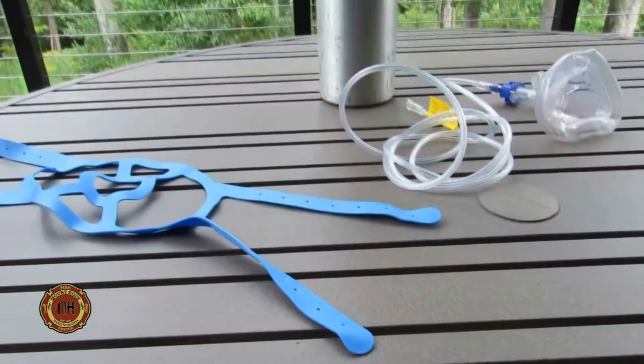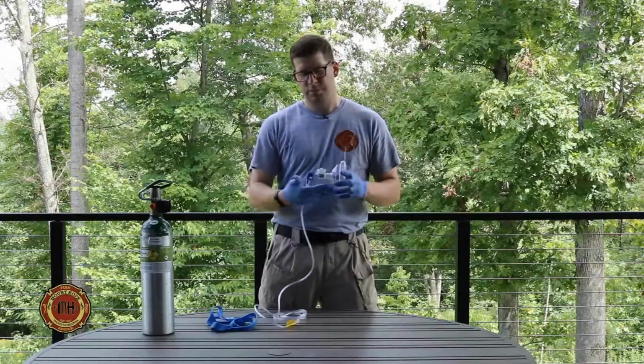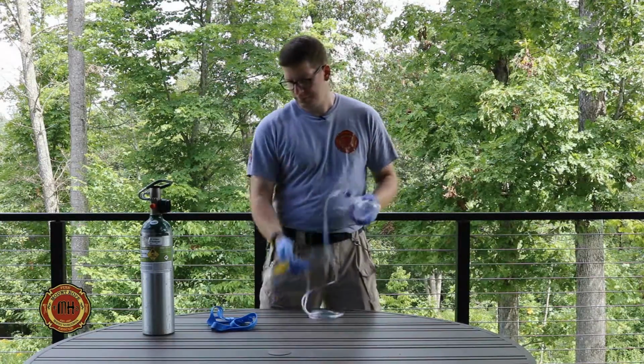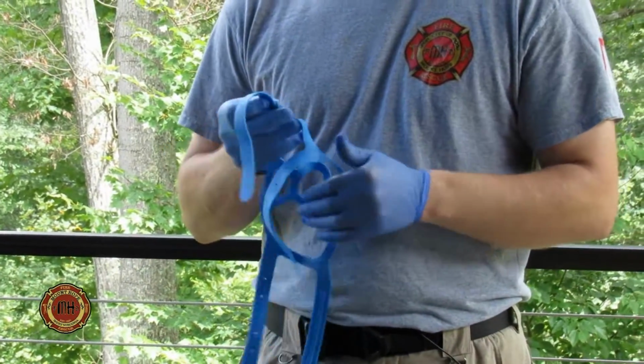Today we're going to talk about using a CPAP device. The one we have here is made by Mercury Medical. It's a disposable manometer, and the PEEP is controlled with the oxygen tank according to the chart that's on the hose. The other device that's on the table is the head strap, if needed for your patient.